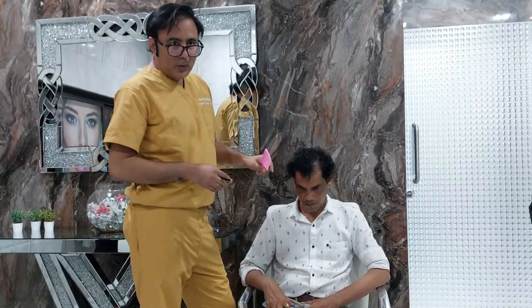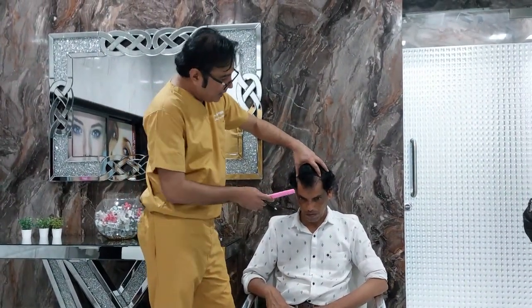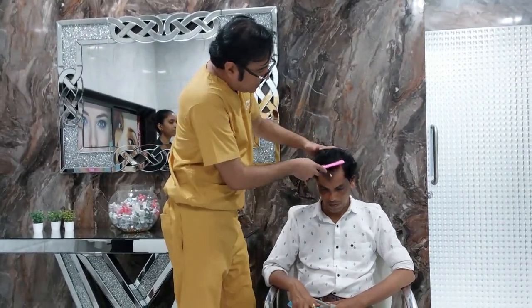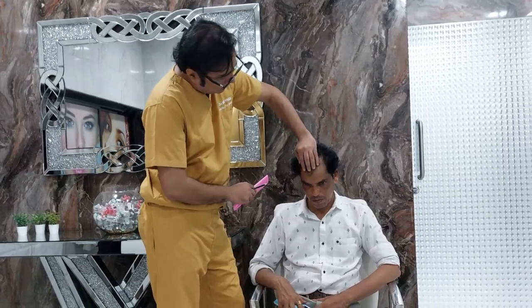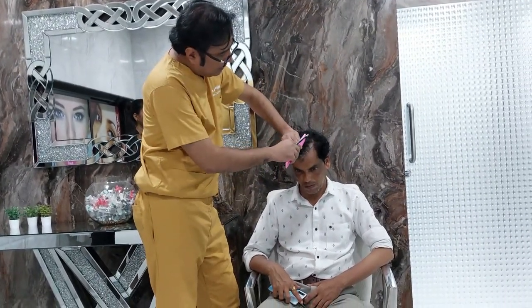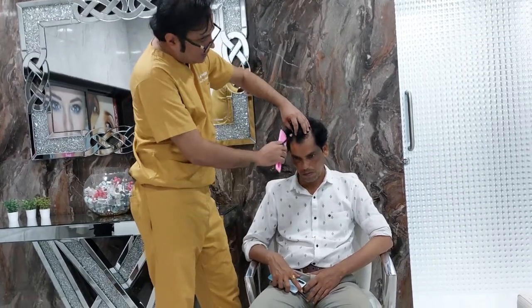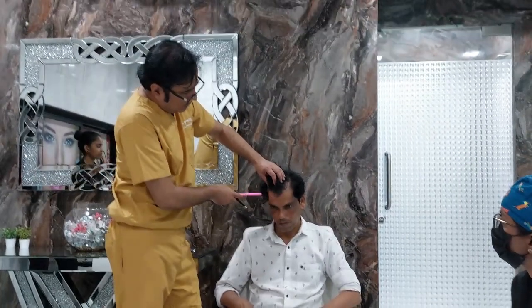So what we are going to be doing today is a hair transplant for this young patient who has almost a grade 2, grade 3 alopecia. He has a frontal tuft here, as I was mentioning, but there is a lack of density in this, and obviously the hairline has receded back. So this is a typical M-shaped pattern, for which we are going to be creating a new hairline.